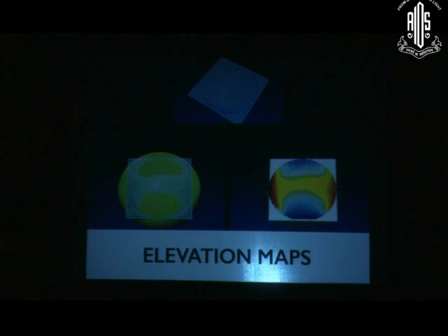Now coming to the basics of elevation mapping. So what is elevation mapping? It is the foundation for the tomography devices. This is a normal cornea, prolate in shape. It is in a grid form, mesh form, represented in blue, and this green color is the best fit sphere. So when you put this particular cornea on the best fit sphere, we find some areas of the net-like thing going behind the best fit sphere. Something is above. Those above are given as steep elevation points, which is given in hot colors. Something which goes below is given in cool colors.